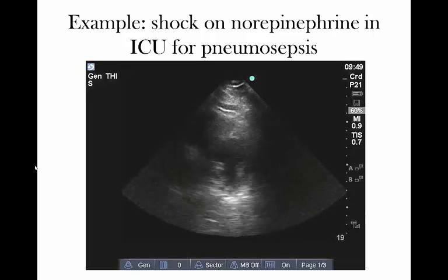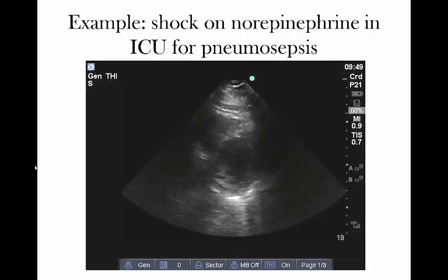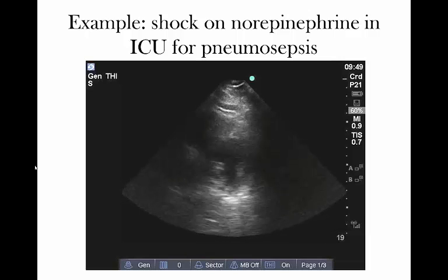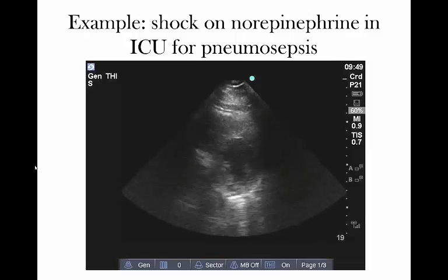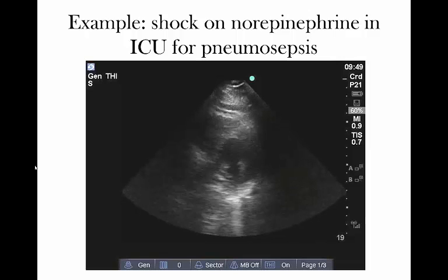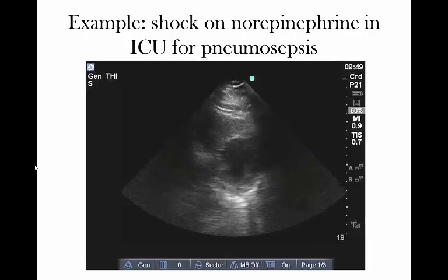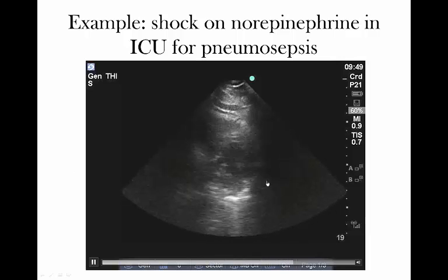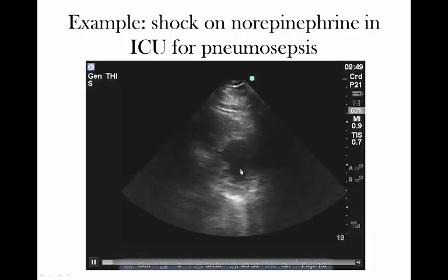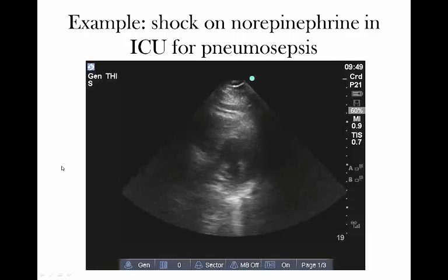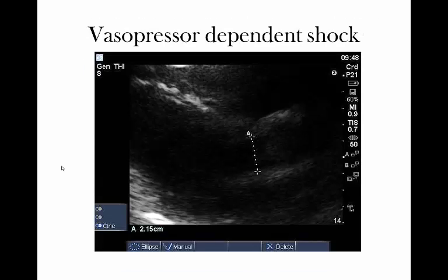Let's look at it again in a different case — a recent case regarding a patient with pneumosepsis in the ICU on norepinephrine for vasodilatory shock. The question was: can we alter the management at all? You can appreciate on this parasternal short axis, slowed down at the papillary muscle level, that contraction appears preserved and we would generally agree this is normal LV function. Going a bit deeper, we measure the LVOT diameter in the parasternal long axis and get 2.15 centimeters, which through the math gives us an area of 3.63 centimeters squared.